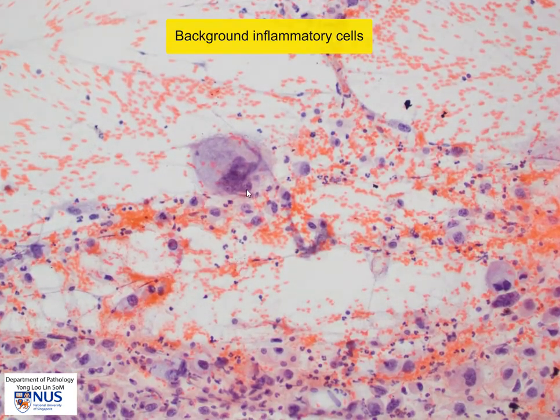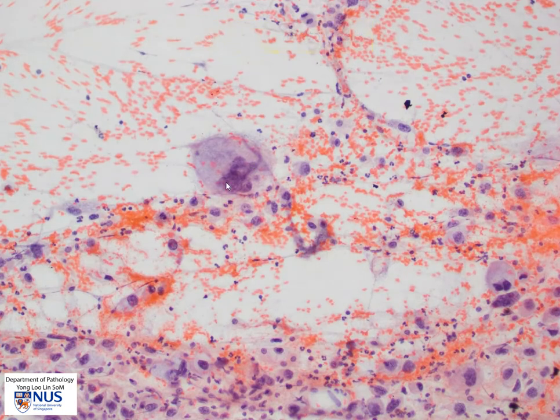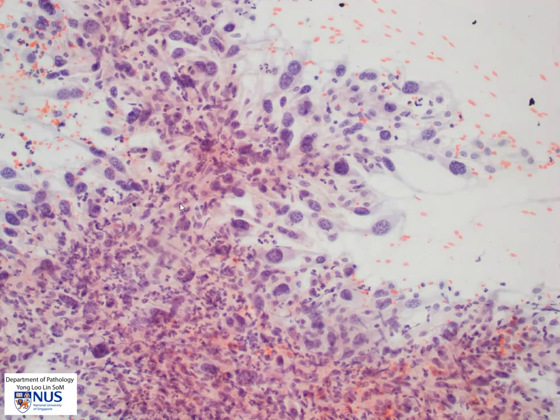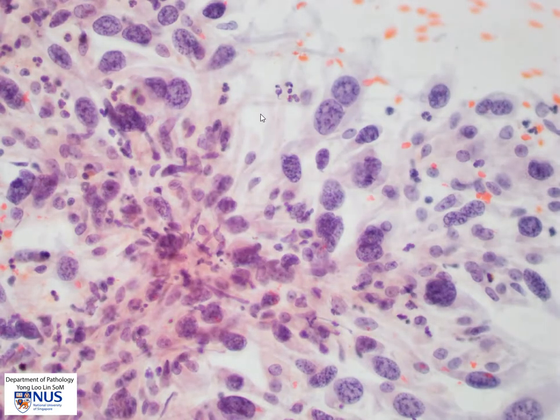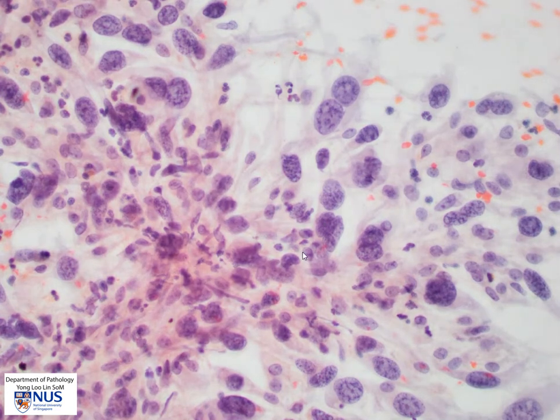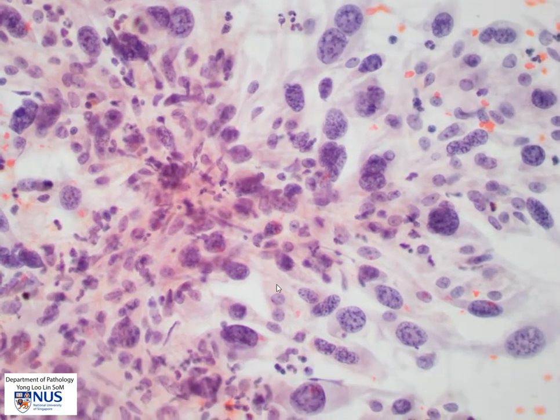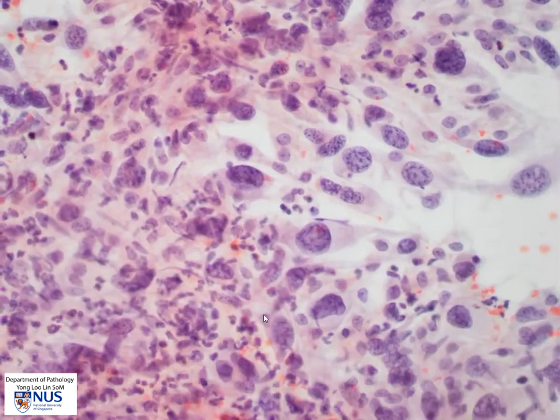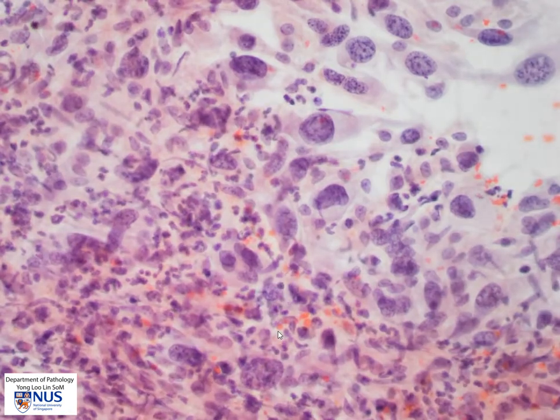Here is a higher magnification view of the large pleomorphic bizarre cell and there is a suggestion of spindling as well in some of the areas. Note the marked acute inflammatory infiltrate that accompanies the malignant cells.